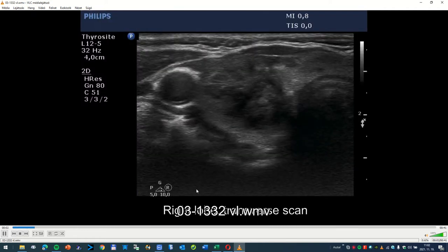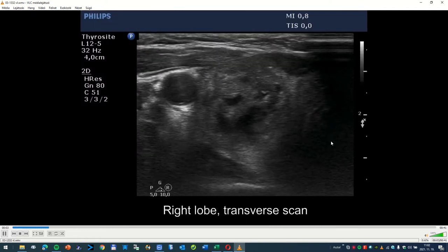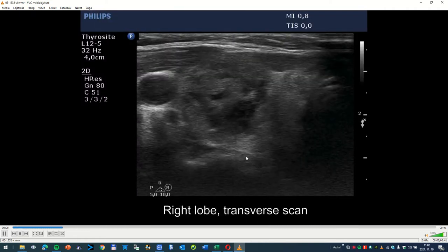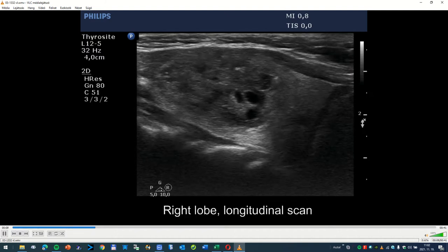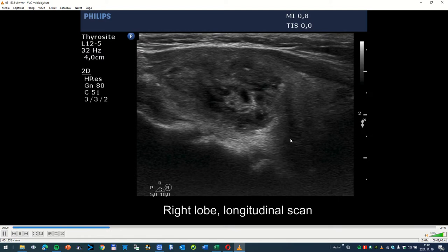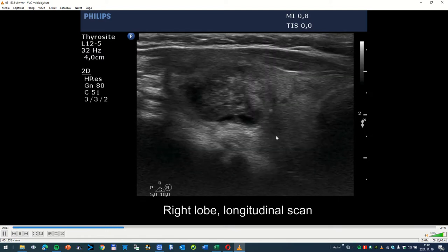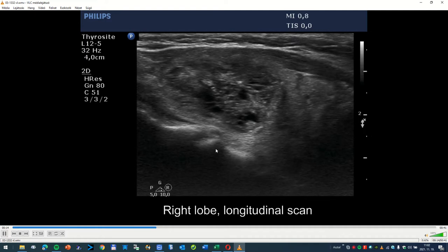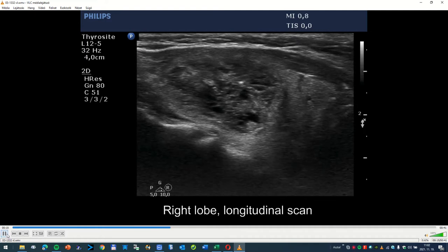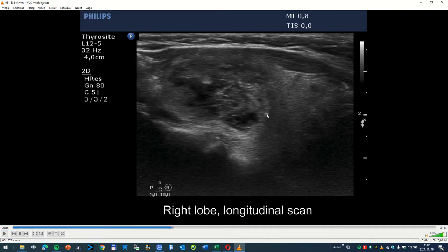Now I present the third case. Here is a large dominantly solid nodule. The cystic content is around 20 or 25 percent, so dominantly solid nodule. I draw your attention to three quite large hyperechoic granules. One is located here, the second is here, and the third can be seen here.